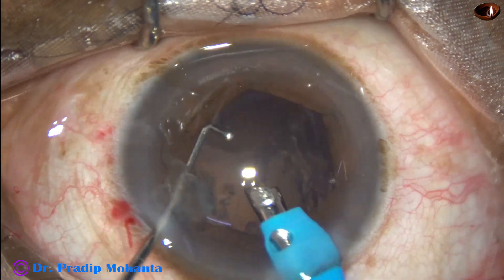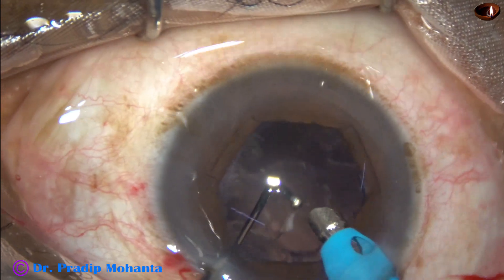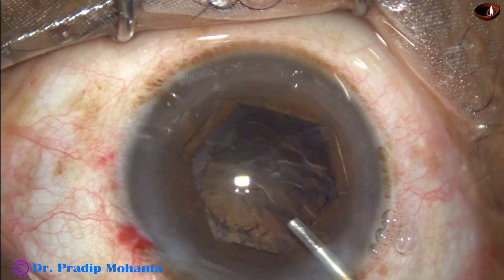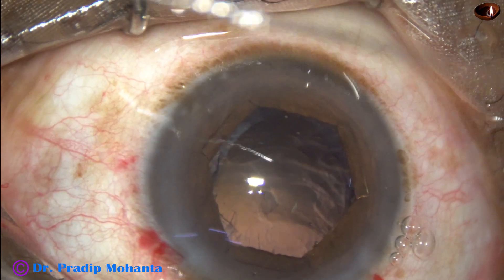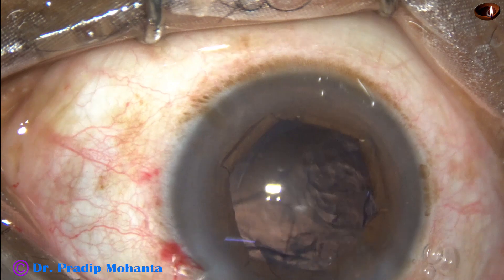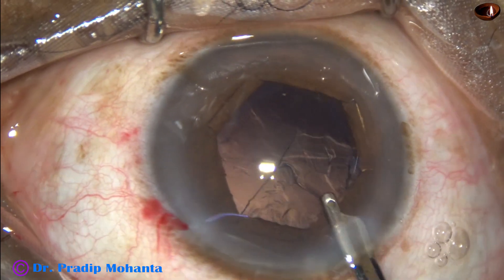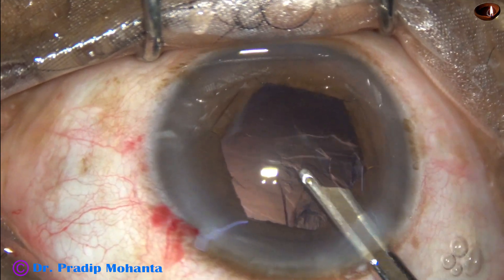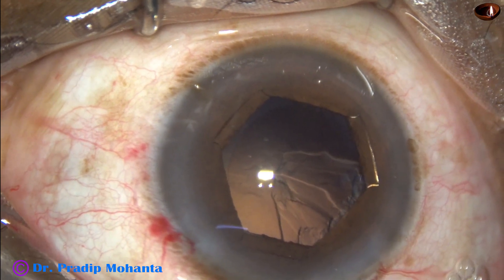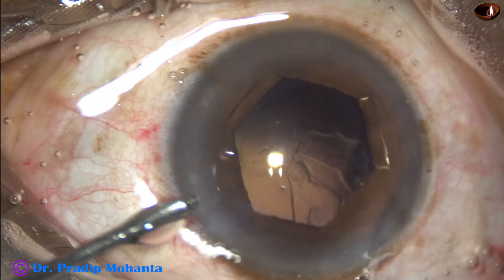Since the nucleus was pre-chopped, it has been emulsified very easily. I tried to remove some cortex with the phaco needle itself but could not. Visco is injected and now I am using a 23-gauge Simcoe for removal of the cortex. Cortex from 2 o'clock to 6 o'clock, then 8 o'clock and 9 o'clock are removed. From 9 o'clock to 12 o'clock, the cortex is not yet removed.